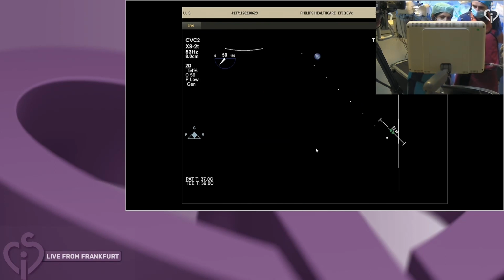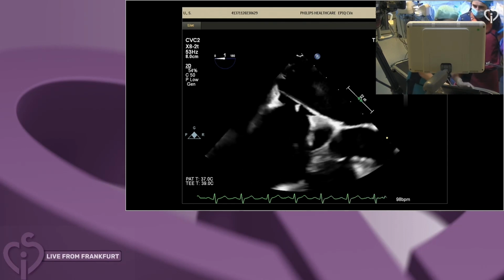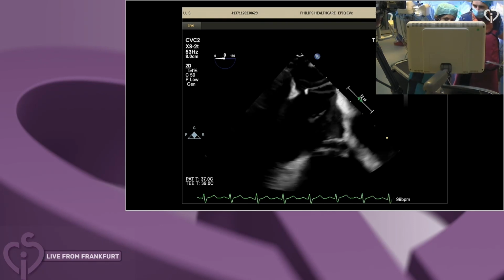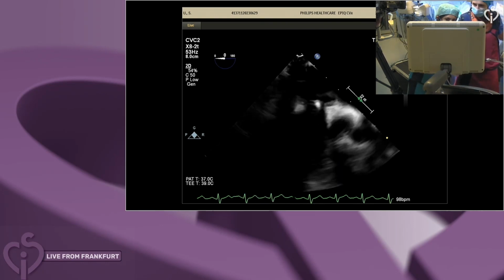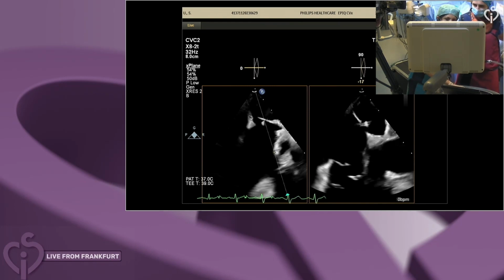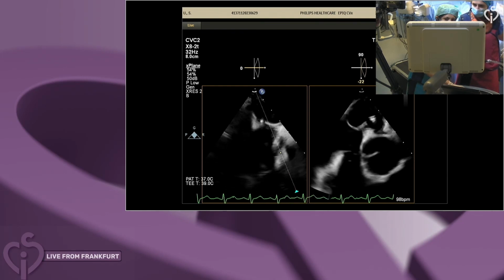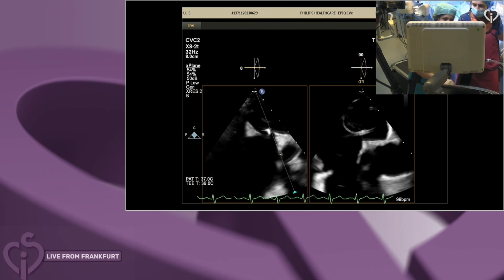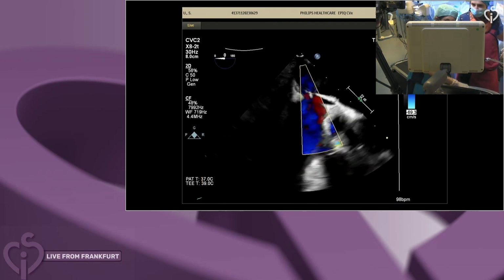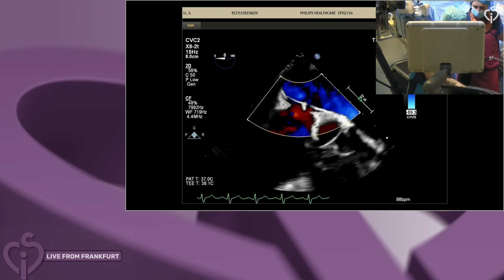So pretty high-risk anatomy. Just quickly going through the 2D, we'll start at 0 degrees, and you can already see the wire through the tissue, and you can see the overlaps that were definitely through the PFO. And if we were to X-plane here, you would then see the PFO on the orthogonal view. I'm just moving backwards and forwards because there's a breathing artifact as well. And then we'll do color compare, because we haven't had a chance to do that yet.